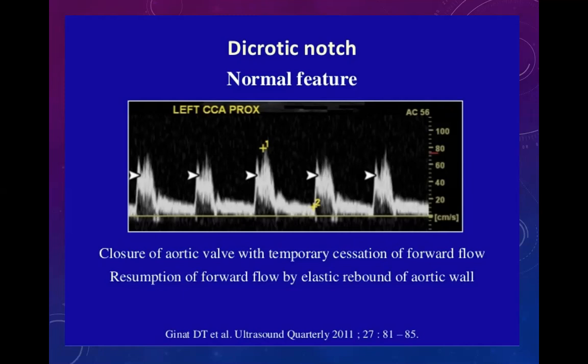But can we call it biphasic? No. That terminology should not be used here, sir, because this is a separate region altogether. I would not like to call it biphasic, but if you're mentioning a dicrotic notch, you're mentioning a normal flow. I think the term phasic shouldn't be applied to the carotid and even the mesentery, because there are different dynamics of the blood flow. There's not much peripheral resistance, as you saw in the peripheral artery. So forget about the triphasic, biphasic Doppler signals in the carotid or renal artery or mesenteric artery.